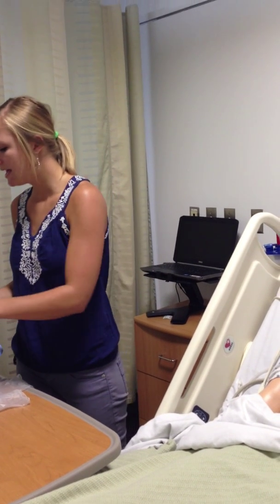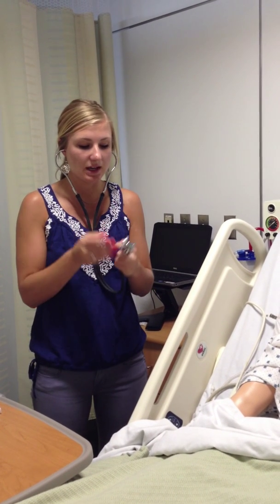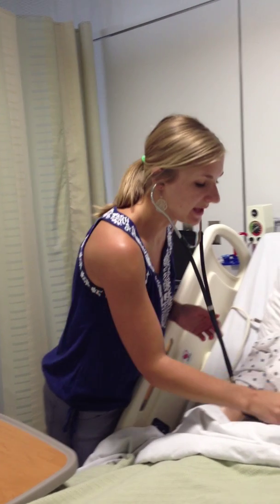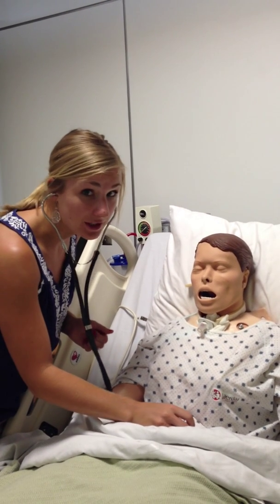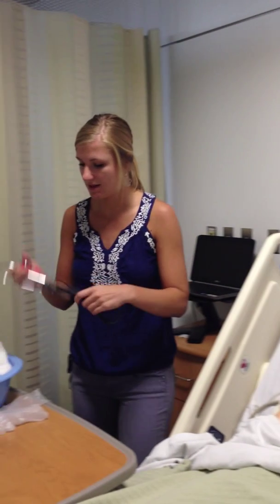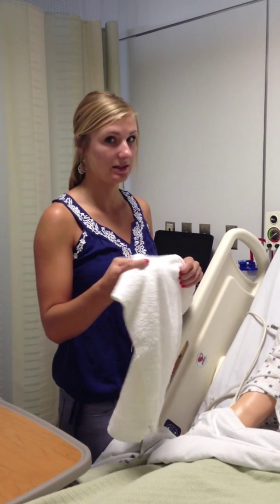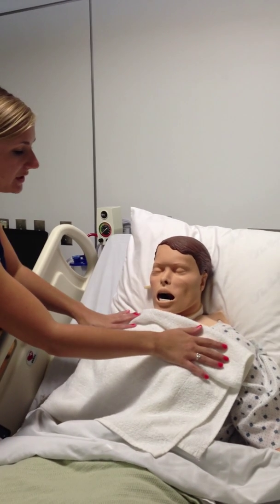The first thing I'm going to do is assess for bowel sounds, because we don't want to put a tube down into their stomach and try to insert food and medications if there's no movement. Our patient does have really good bowel sounds, which is awesome. I'm also going to assess their ability to cooperate with the procedure, any presence of a gag reflex, and which nostril is the most patent for a tube.